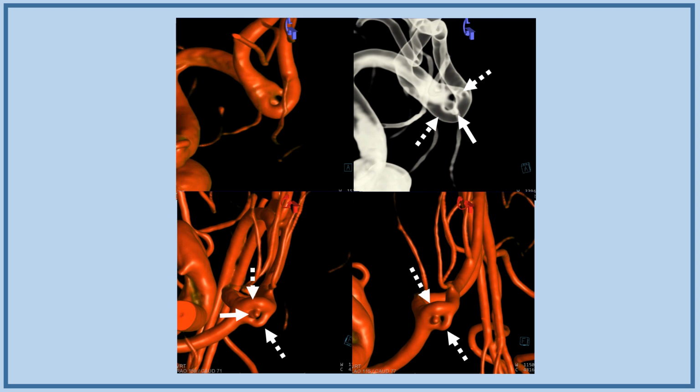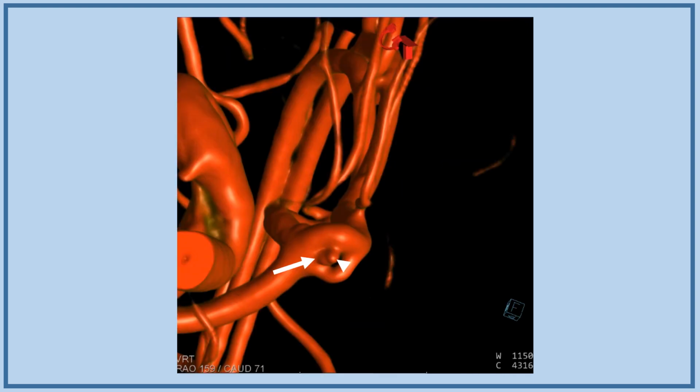We have several views. The views on the bottom are from the bottom, unrealistic kind of a view, at least from the angiographic and the operative perspective. But that allows us to really optimally see this aneurysm. In fact, when we look at this picture, you can even further appreciate that there are two components to this, right? That's the typical appearance of a ruptured aneurysm.